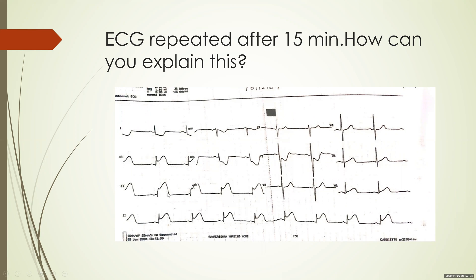The ST elevations are more prominent compared to the pre-lysis ECG, and combined with the increase in chest pain, this is a failed lysis — you need to do something about it. So you had an inferior wall MI initially, which went to a lateral wall MI, and now has come back to an inferior wall MI. How is this possible to explain?